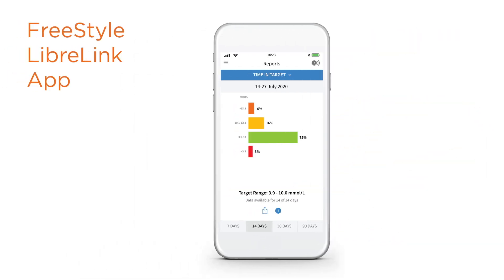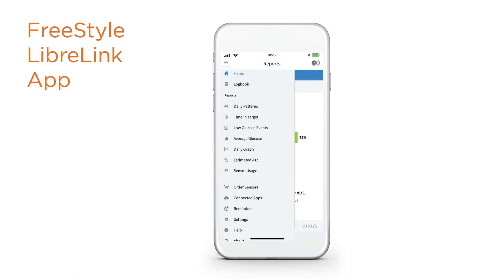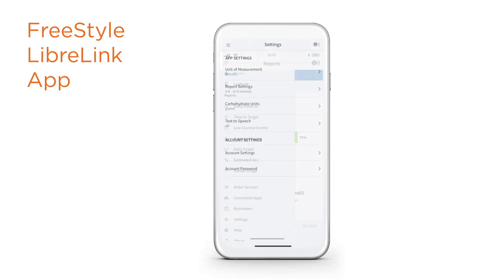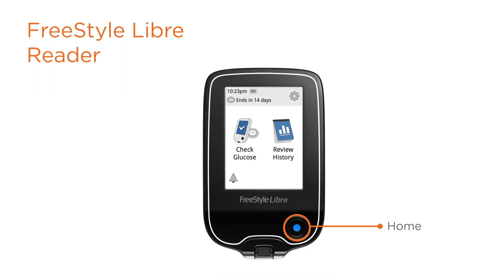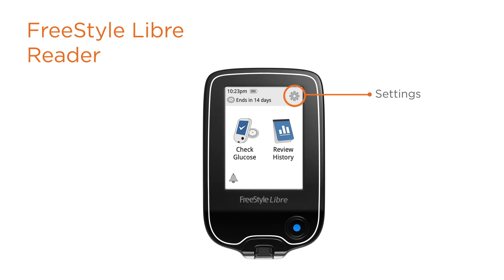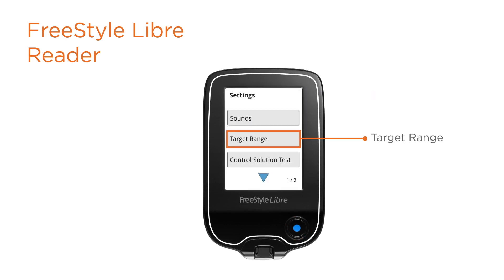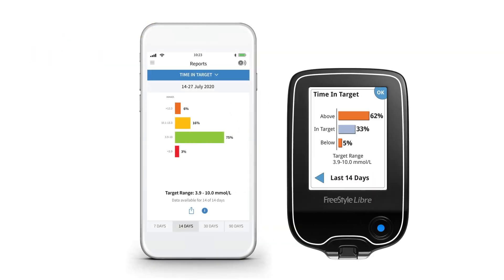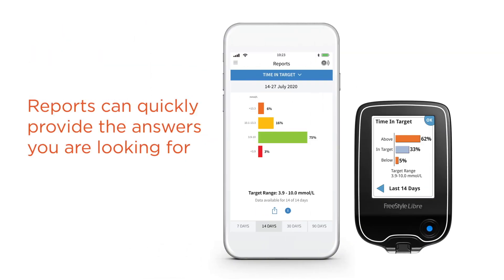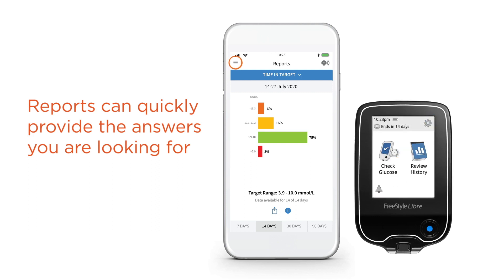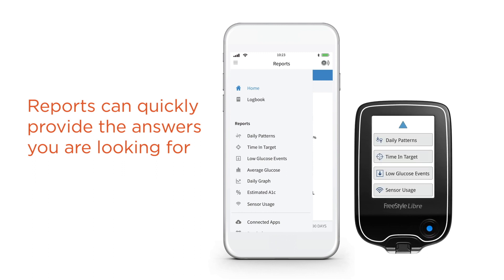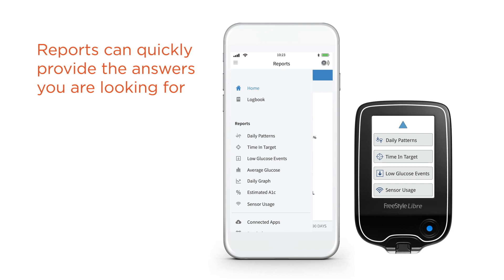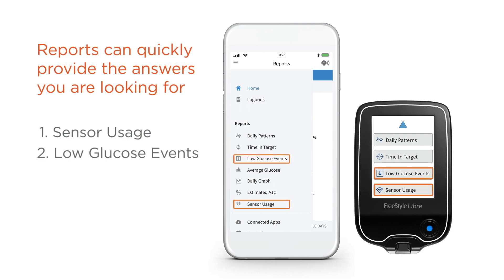You can check your target settings by going to menu, settings, report settings. Freestyle Libre reports quickly give you the answers you are looking for. To see your reports, click the menu button in your Freestyle Libre link app or access the menu on your reader. The reports we're going to look at are sensor usage, low glucose events, time and target, and daily patterns.